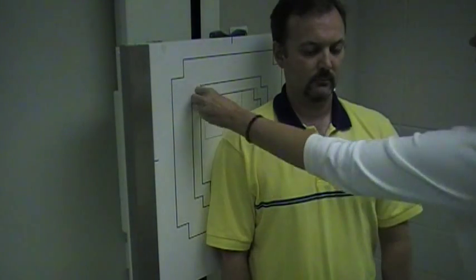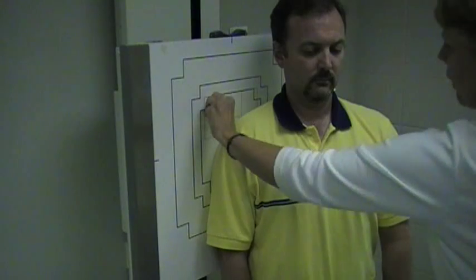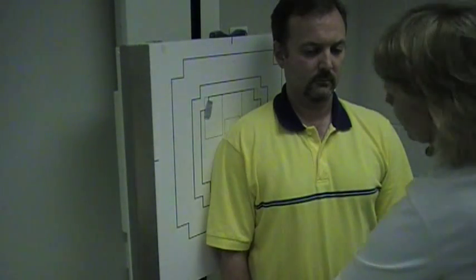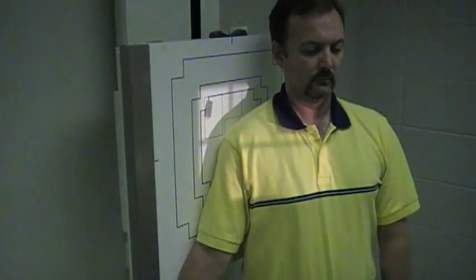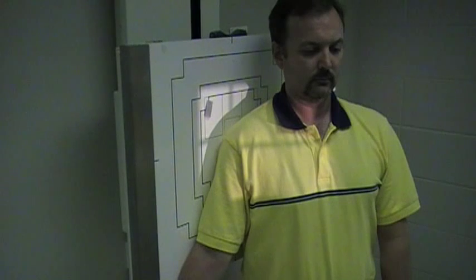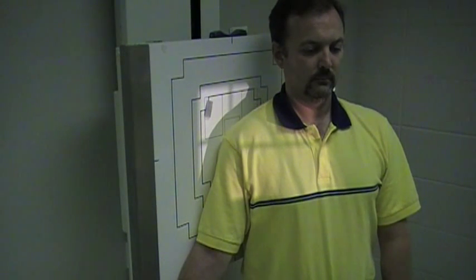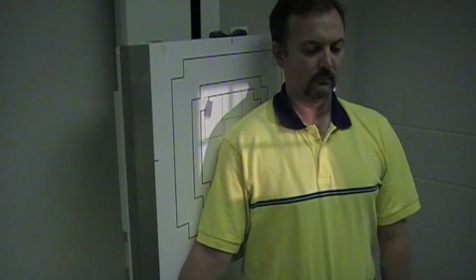Make sure your right marker is showing, and I'm going to bring the arm out from the side. And this is our Grashy method for seeing the glenoid cavity.